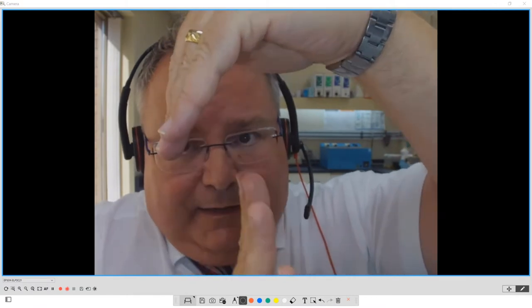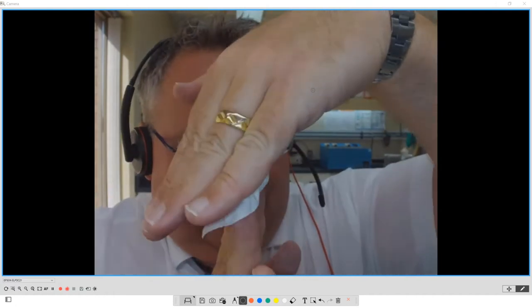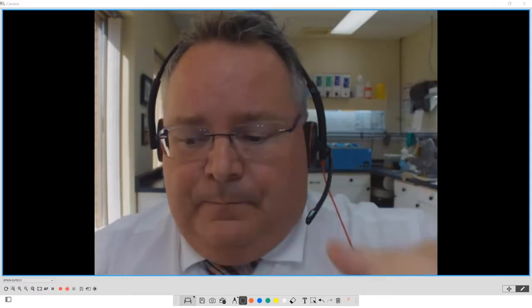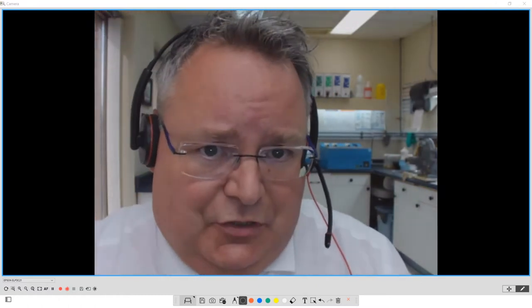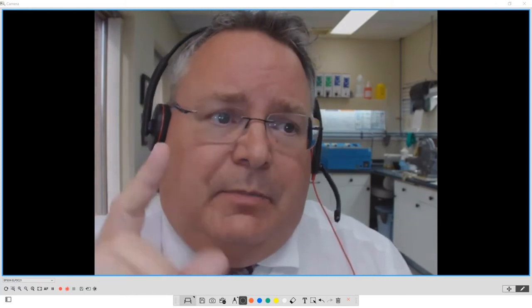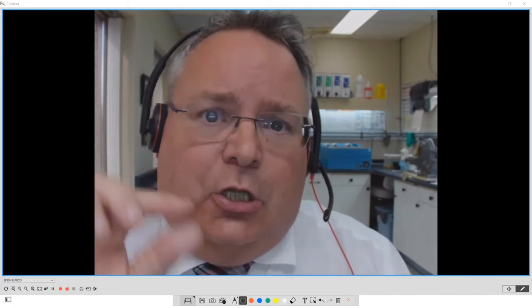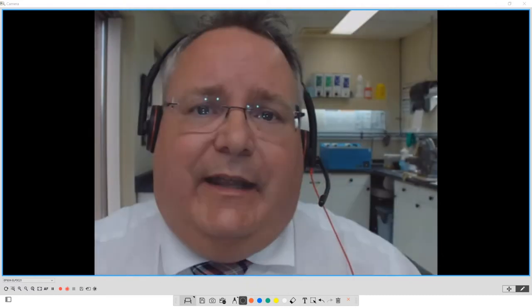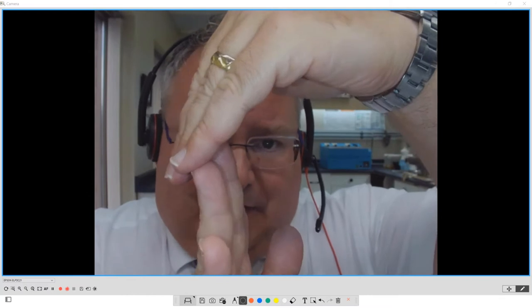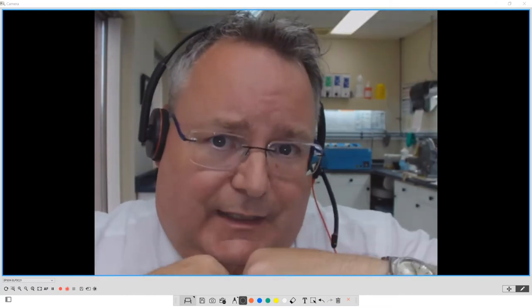When they come in, they're coming in to touch, and it's typically not end-to-end. It's coming in on the lingual, and that's what holds the food and bites the food off. They're not coming end-to-end as they come forward; it's coming on the lingual. That's what happens in natural dentition. Now, I appreciate that artificial dentition can't always mimic natural dentition to each degree. We need a little bit of freedom there. Why? Because there's no nerve. This is denture integration into the body. The patient cannot tell accurately, so we have to allow them a little bit of that freedom. They can't go end to end because they can't tell it's end to end. They need to come in and they're going to touch on the lingual. But remember, there's food in the way, and that's what's bracing it, and then they tear it away with their fingers.